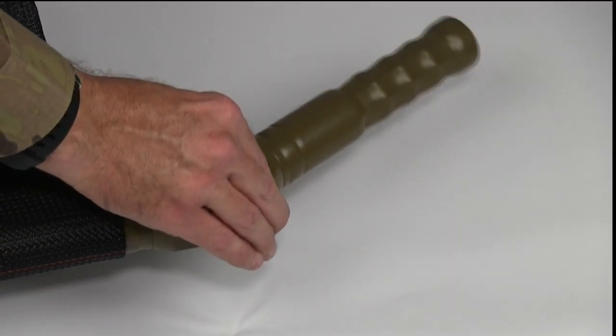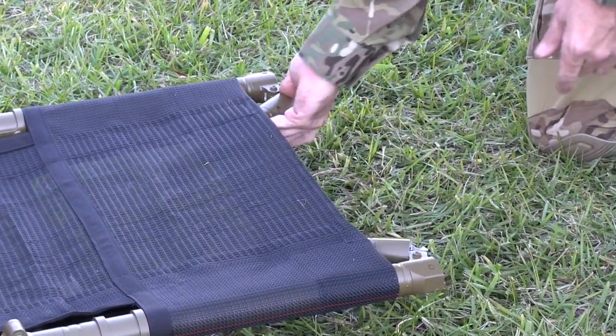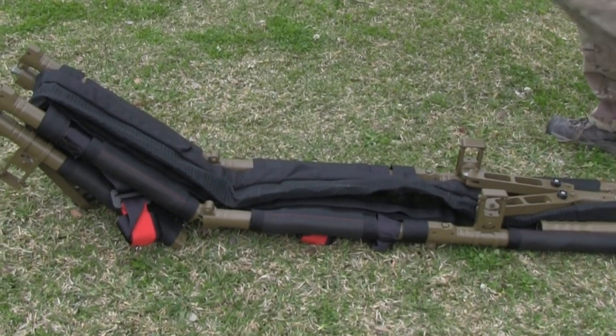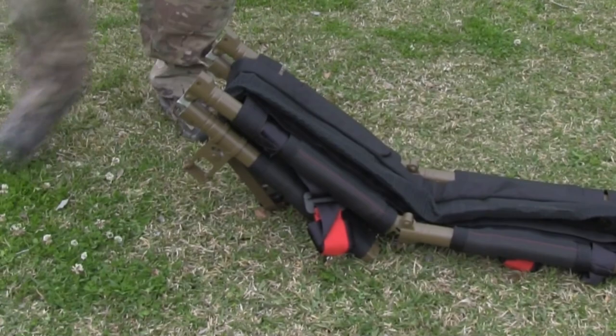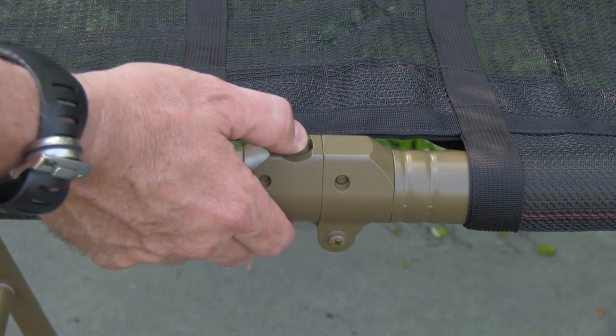All four litter handles easily fold with the push of a button, reducing the length of the litter without compromising the rigidity of the litter frame. The six frame hinges independently lock on deployment as the litter is laid out on the ground. Unlocking of the hinges is accomplished with the push of a button for breakdown.